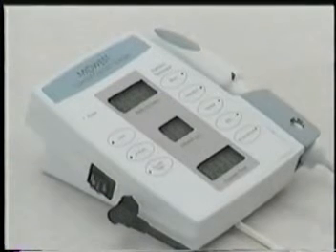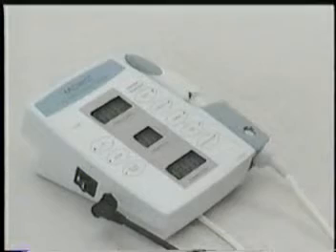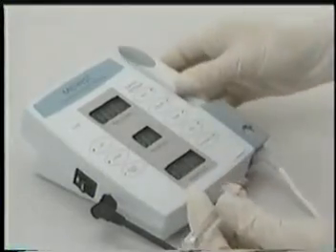technique. Begin by ensuring that the base unit has been turned on. If not, press the rocker switch to the on position. Load an anesthetic cartridge, metal tip end first, into a cartridge sheath. Insert the loaded plastic cartridge sheath onto the handpiece.